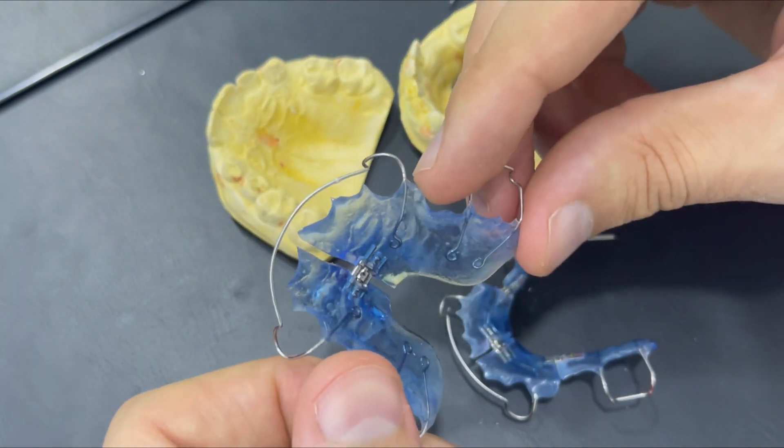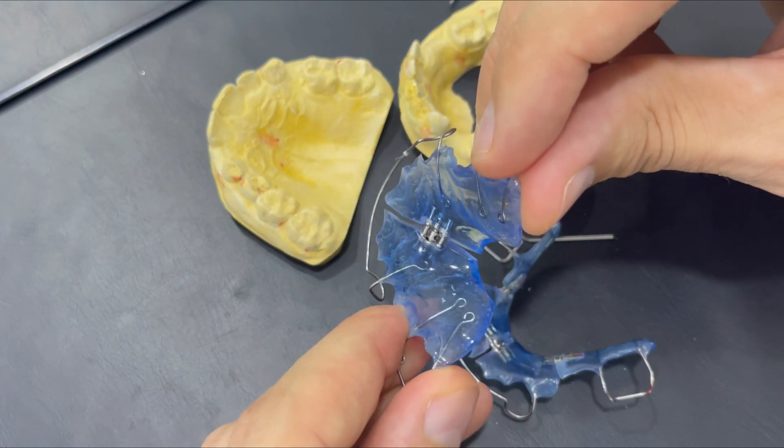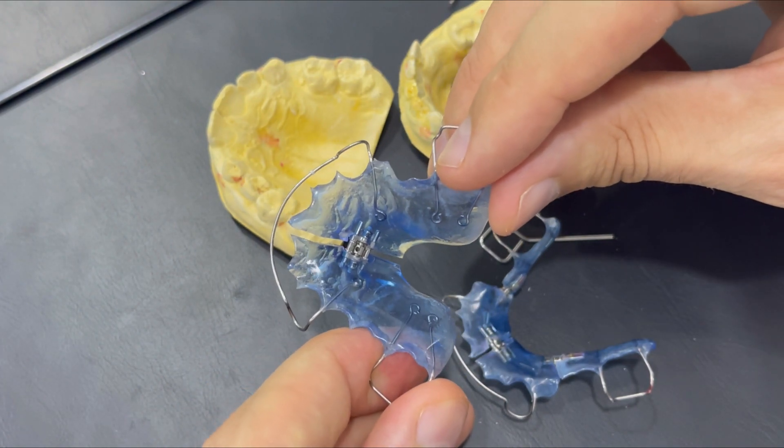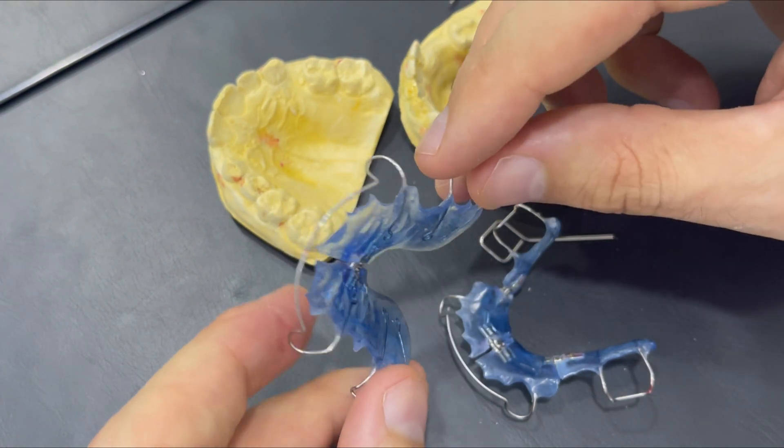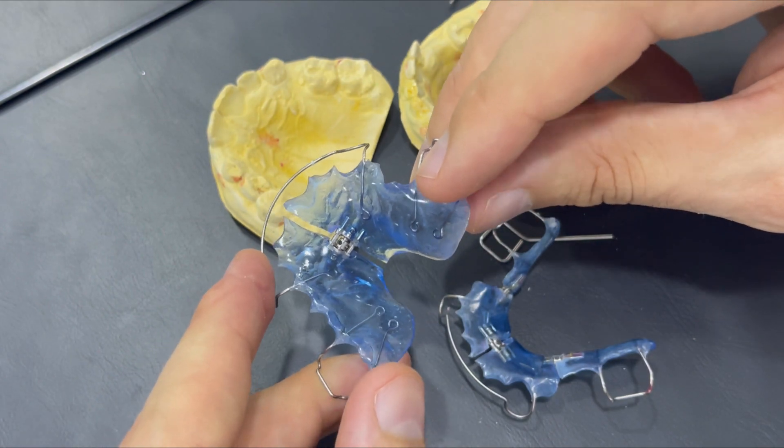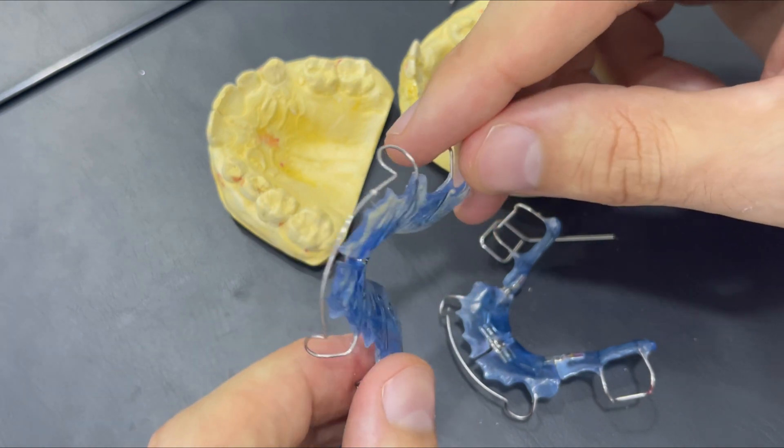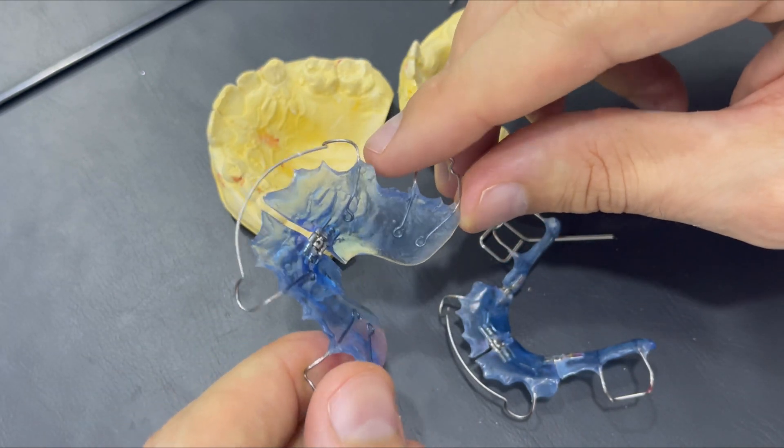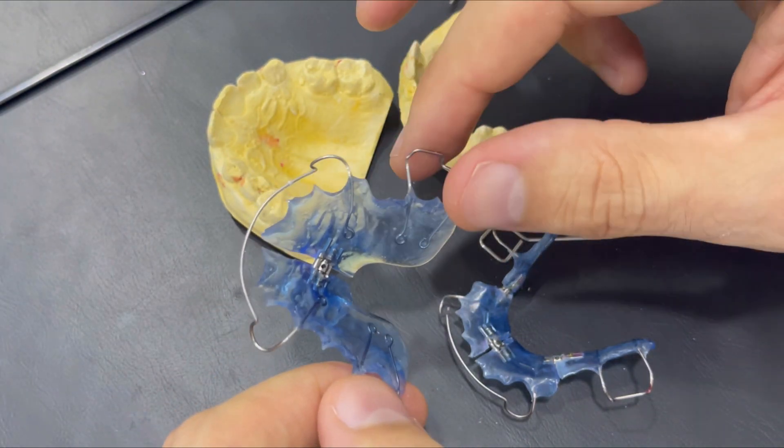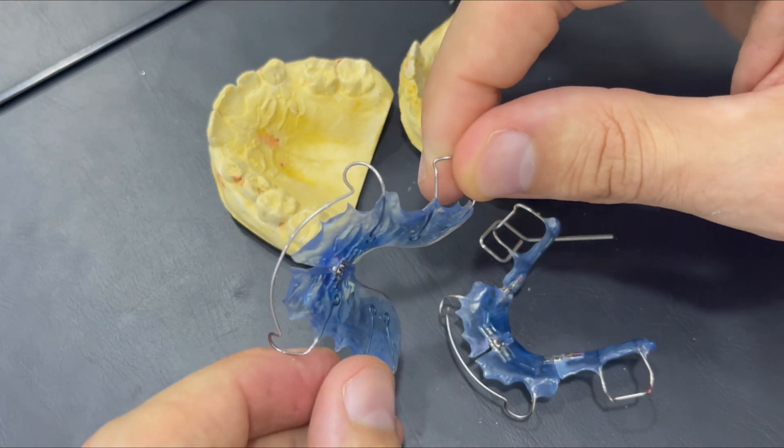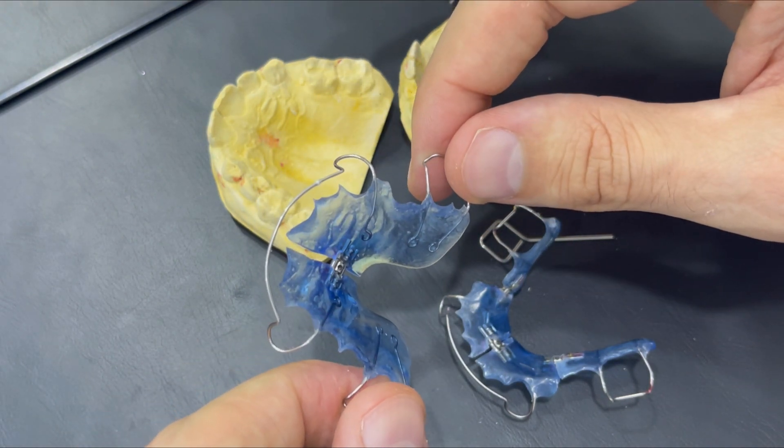Now the difference between the removable expansion and the fixed one: the removable one is more for dental expansion, and actually we prefer always the skeletal one. Skeletal expansion means the bone expansion. That means we are providing more space for the nasal airways.